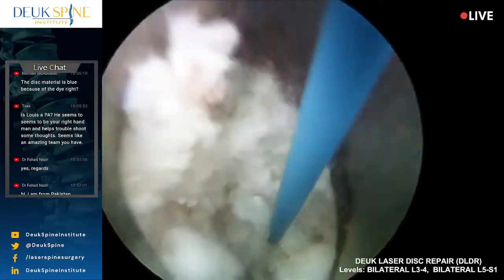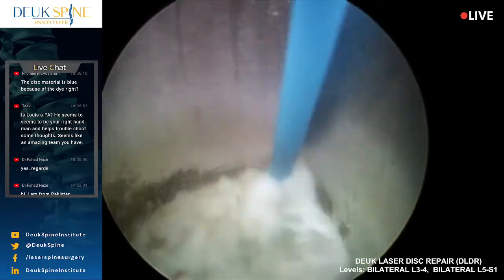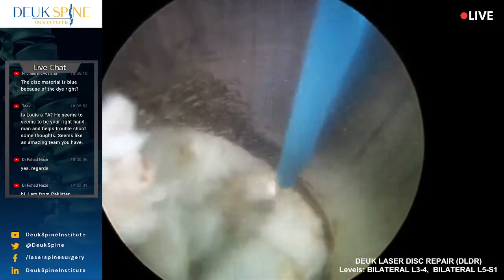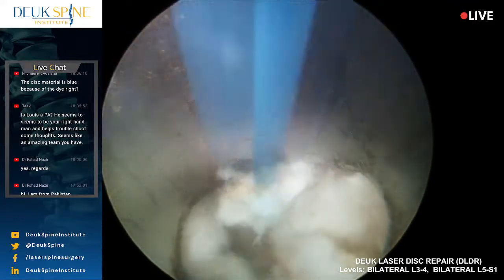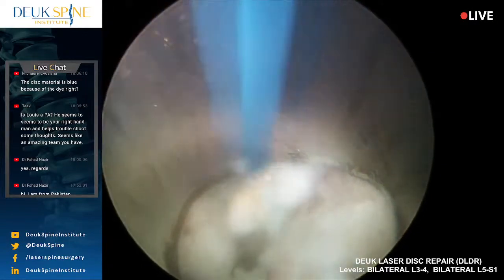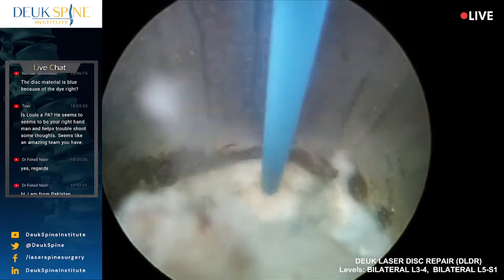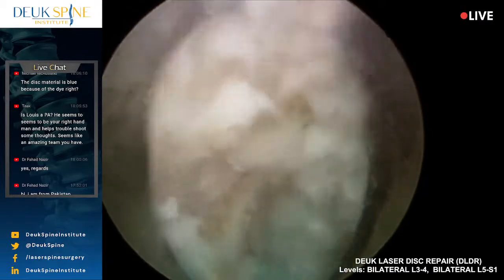Stay still, you're doing okay. Just about done. We still have the last disc to do.